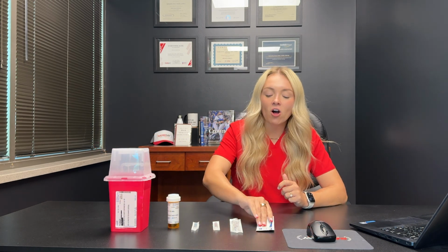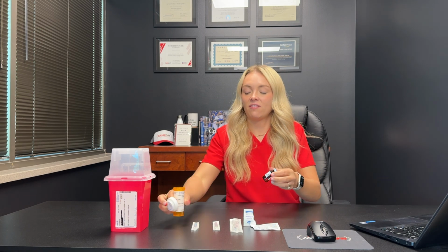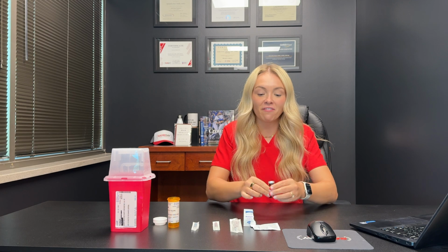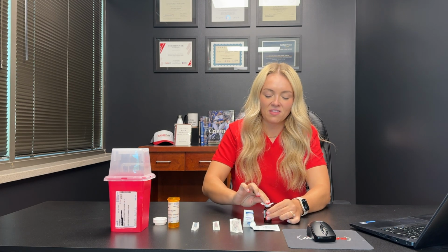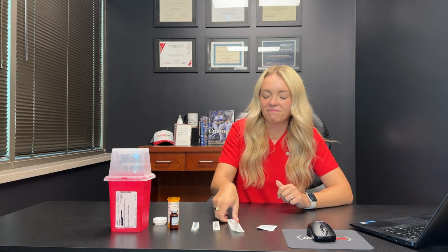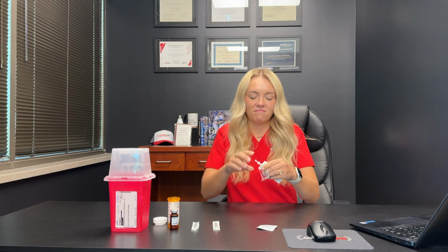First, you're going to take an alcohol prep, and you're going to use it to wipe the top of the vial. If there's a cap on top of your vial, just pop it off. Next, open the package that has your syringe in it. Next, we're going to attach our first needle. And remember, ladies first, pink before blue.